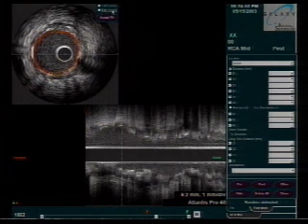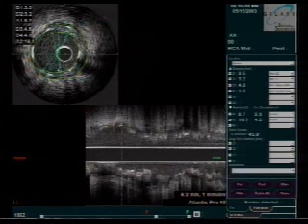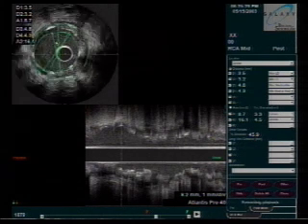Now in the vessel, there's still some plaque. That's why we didn't take the artery all the way up to 4 millimeters. We had to leave some room for that atherosclerotic material to be pushed back and contained. But now if we make some quick measurements, we see that in this artery that's 4.8 by 4.3, we have a lumen that's 3.5 by 3.2, where it was 1.2 by 1.7 before. So with lumens this size, there's a very good chance this is going to stay open and should provide the symptomatic relief that he needs to get back to the lakeshore.